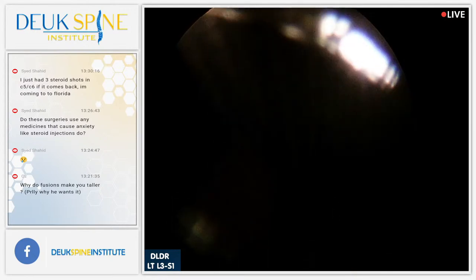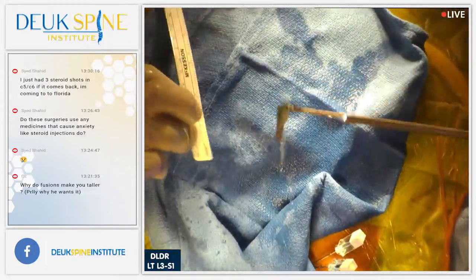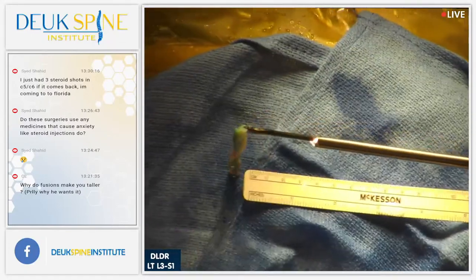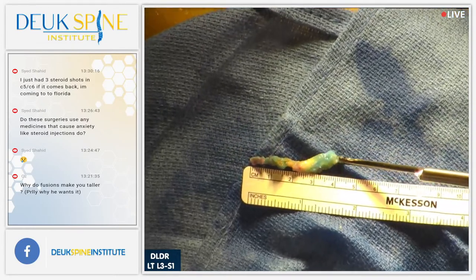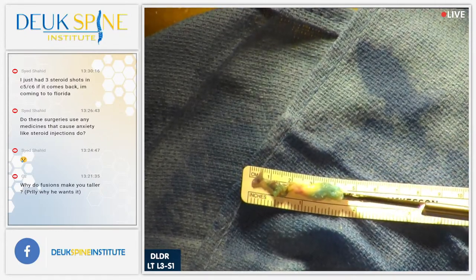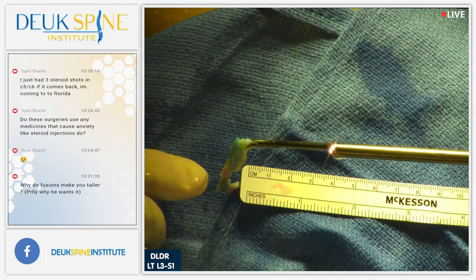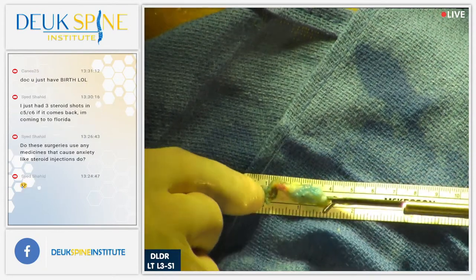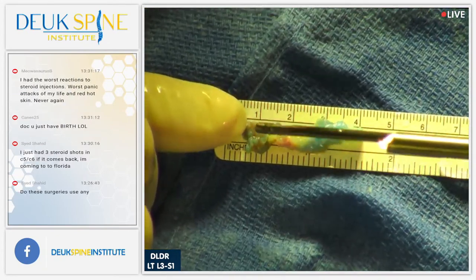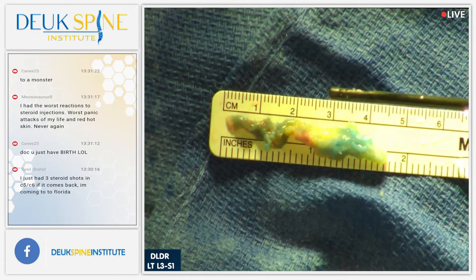You're doing great. Oh, there it is. Put the light on. Camera on. Here we go. Wow. You guys see this? No wonder he's wiggling around. Hey, Henry, you see this thing? Yes, we do. That's like literally fishing a whale out right there. That is huge, guys. Look at the size of this herniation. It is quite literally 2 inches long. Hey, help me out here. Hold the tail. Wait, let me lay it down. This is like when you go fishing and you catch that really big tuna. There it is. 4 centimeters. No, more than 4. Almost 5 centimeters.